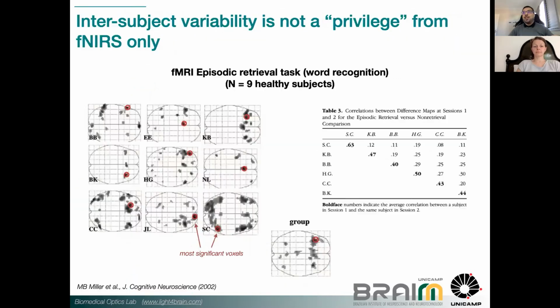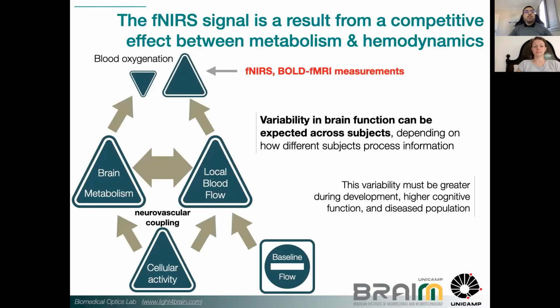So as I just showed from fMRI, it's not just because we have a group activation in the prefrontal left hemisphere that all subjects use that hemisphere. Some subjects don't use that hemisphere at all to do the cognitive task here. And if you want to use this information for something, it's better to use the information from the individual subject and not from the group average.